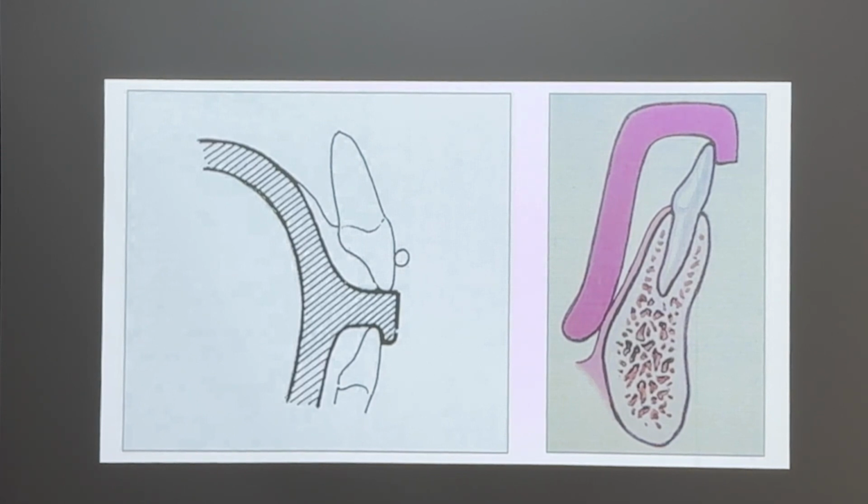Please don't use this kind of denture bar. Curved surface, I never recommend it to you. Okay? So a straight surface we need. Please select a straight line of denture bar. Okay?